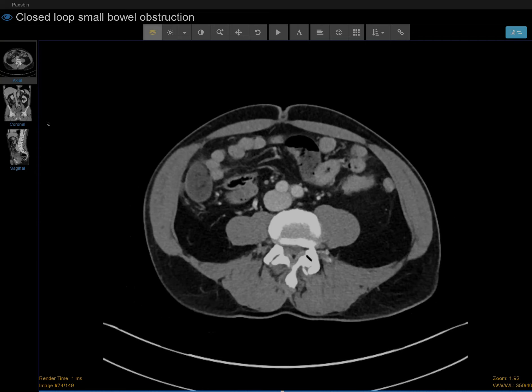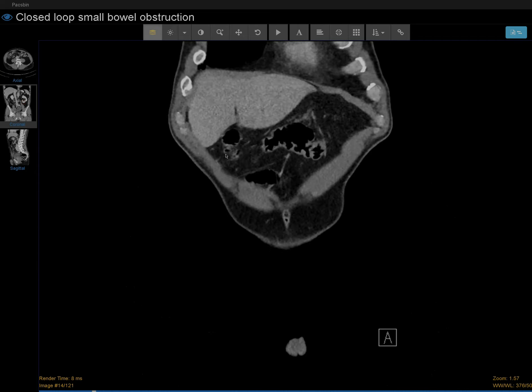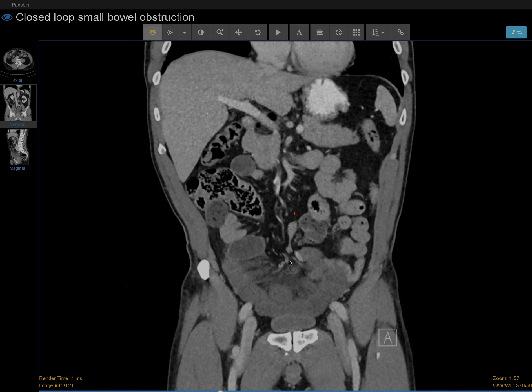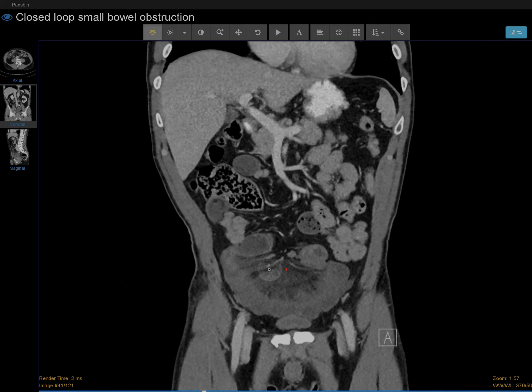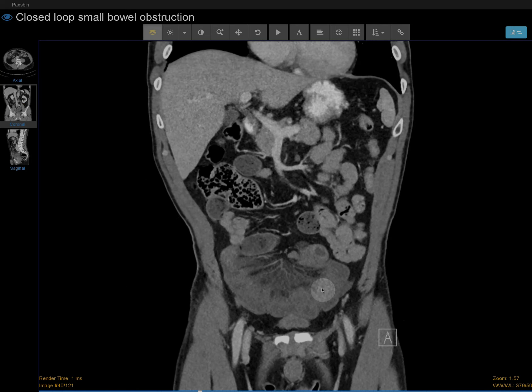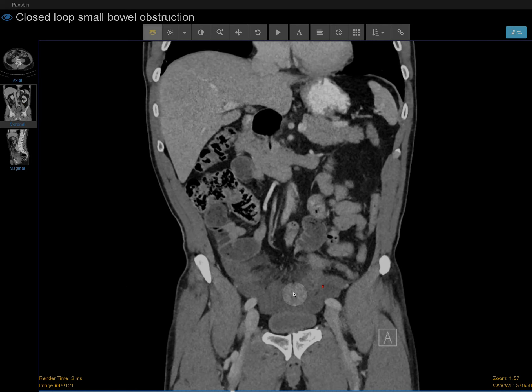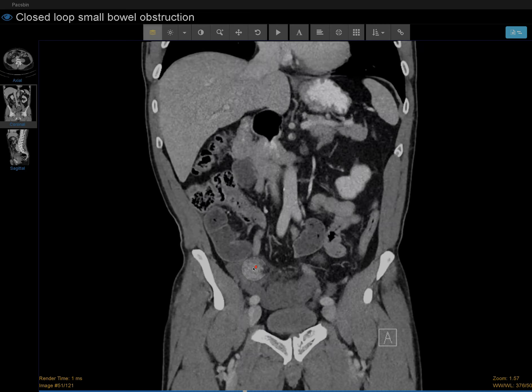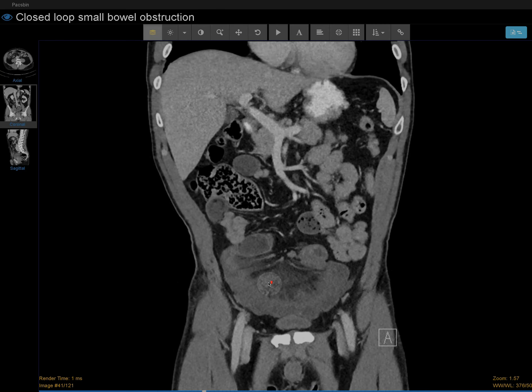Now let's try to look at it in coronal view to see what we see. This is one of the loops of bowel that's abnormal, and there are other loops here. Anytime you see this C-shaped loop of bowel with edema in the mesentery, you have to think about the possibility of closed loop obstruction.